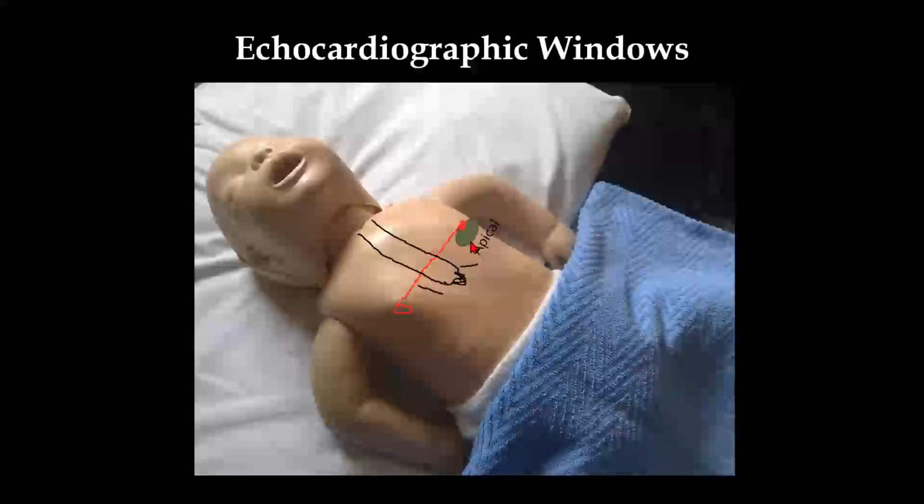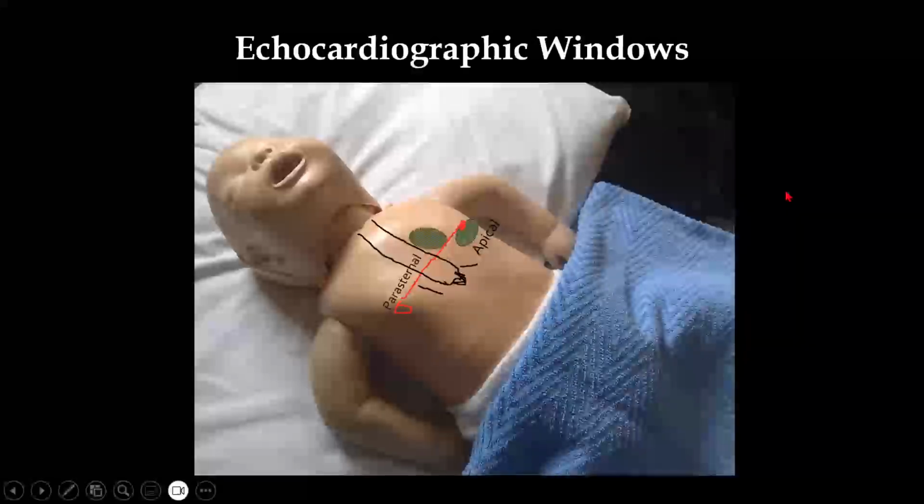So one is apical views, and then you have parasternal views. Parasternal views are two: low parasternal and high parasternal. Then you have the suprasternal notch, that is for the aortic arch view. That also comes in the category of high parasternal. And then you have the subcostal views, just below the xiphisternum.